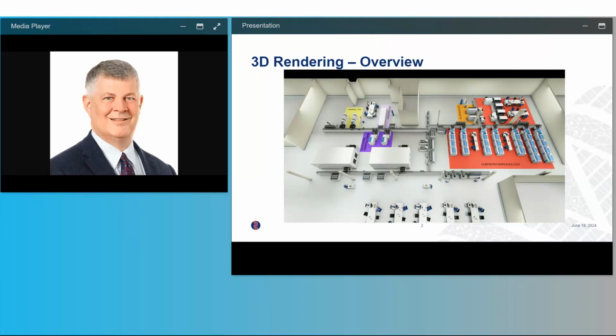We have 2 units that are capable of storing 240,000 tubes each. And then along the lower bottom part of the track system is our pre-analytical places, where we have our bulk input modules, I/O modules scattered throughout the track, and our decapping, resealing, shaking, and aliquoting scattered throughout the system. We believe this is a great start to automating our laboratory. We've designed it such that as we grow, we can add to it both in the core laboratory and we can add additional departments.